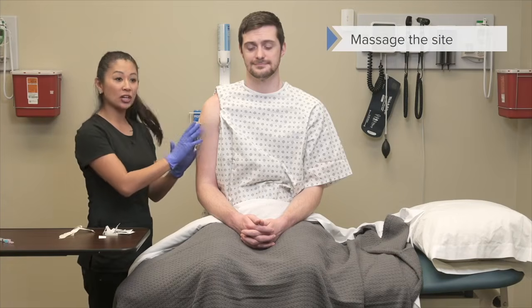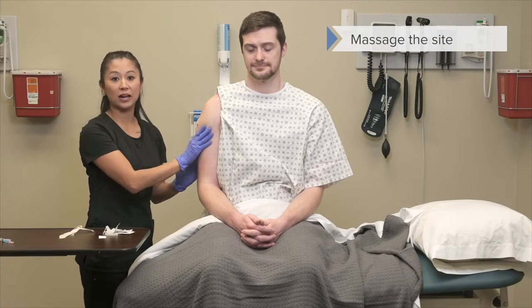Also, with an intramuscular injection, sometimes these are painful, sometimes the medication is thick. This injection is okay to massage the site. So after I've given the injection, I'd like my patient to sit in a waiting room maybe, or sit nearby. That way we can assess the patient for the medication effectiveness and also make sure my patient doesn't have any reactions.